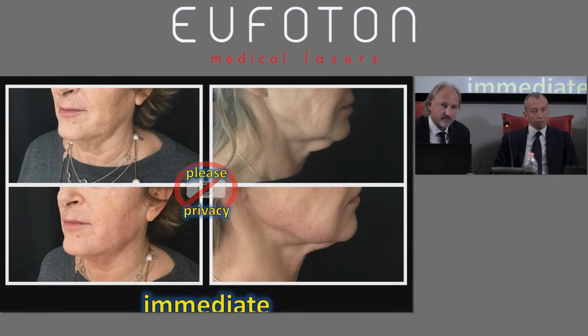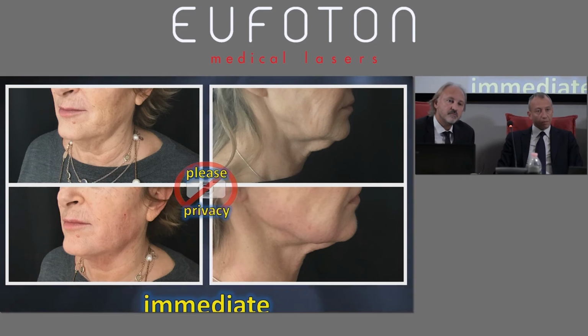And there we cannot do liposuction, or it's more difficult. So we can do Endolift just using the fiber on its own without any local anesthesia because it's not painful. Is this the only reason, because it's not painful, or because it is more effective? For example, I like to do some minor anesthesia just because the patient is very sensitive, 5 or 10 mL. Will it make the treatment less effective?